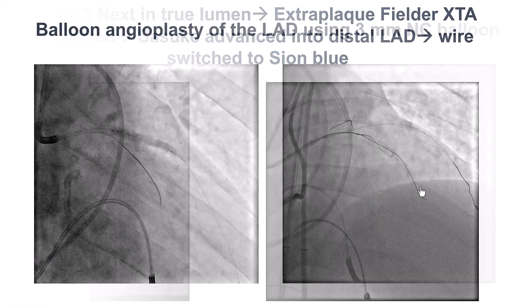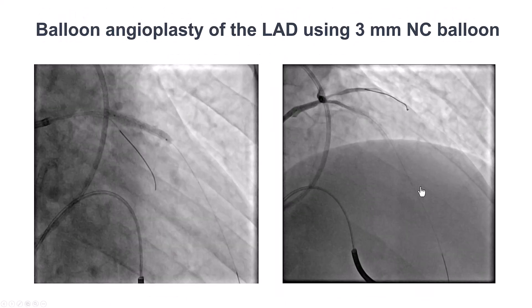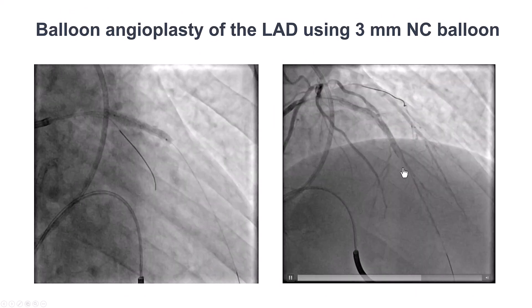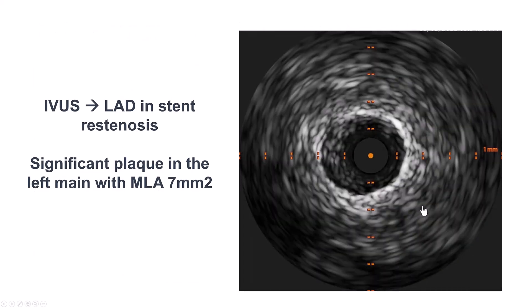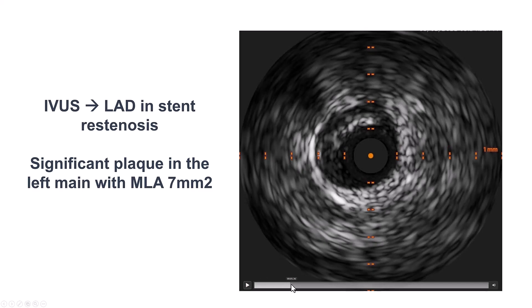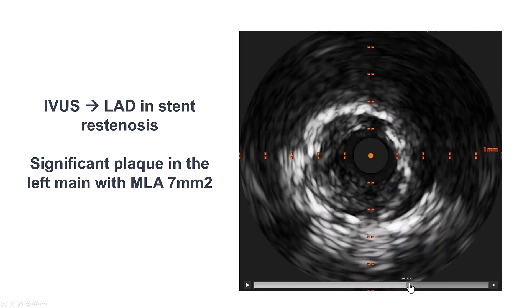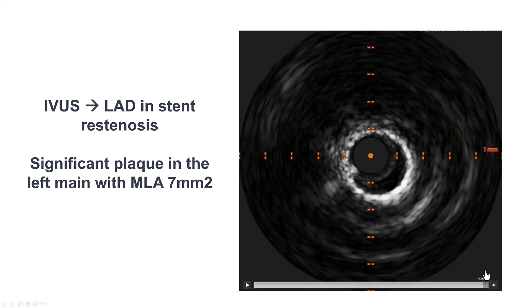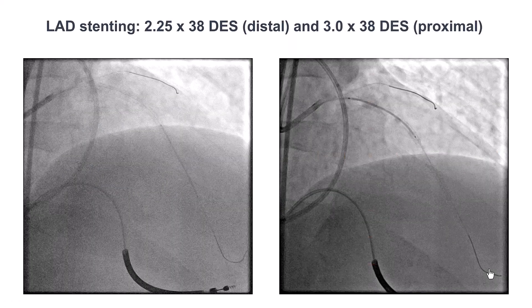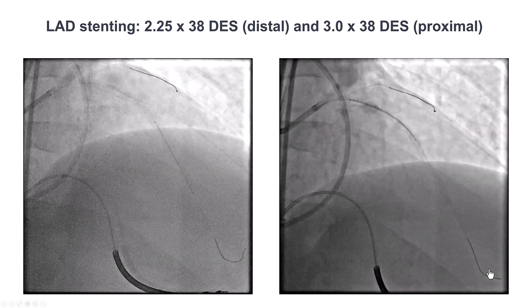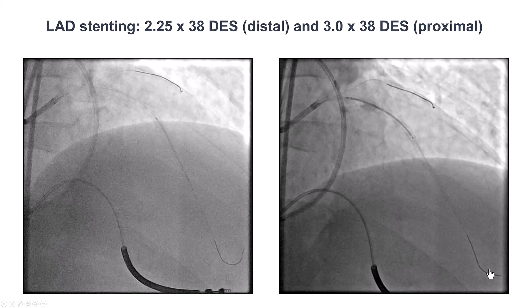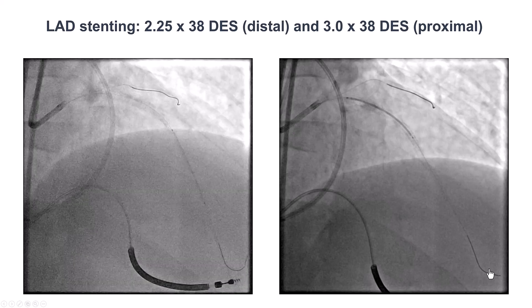We switched the guide wire to a workhorse guide wire and then performed balloon angioplasty on the LAD. There is still some poor flow distally, so we performed IVUS again to check the vessel. There is some diffuse disease, and there was a lot of plaque into the left main. The left main actually appeared to be significant. The MLA was 7 mm squared, which was something we did not fully appreciate when we started the case. So we do have, in addition to the LAD CTO, some left main disease. But the patient did remain very stable throughout all these crossing attempts.